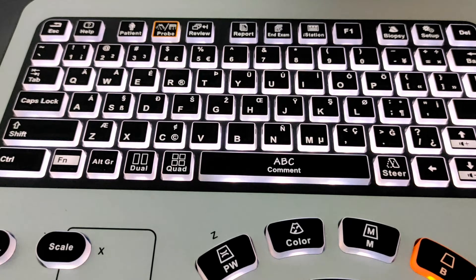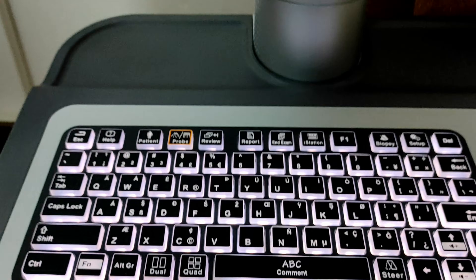This one is our comment button. If you want to write anything on the screen, just press the comment button and type here.